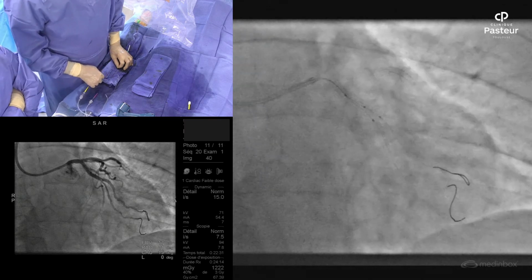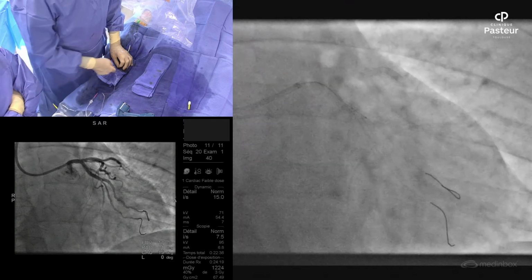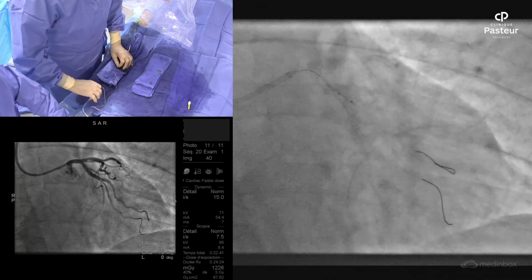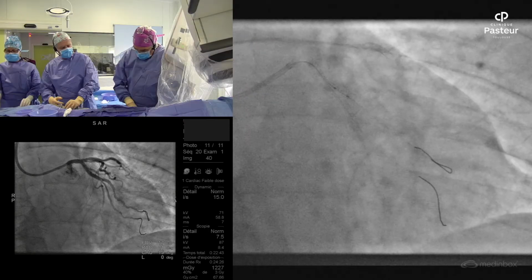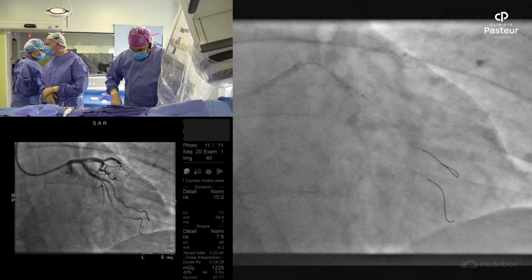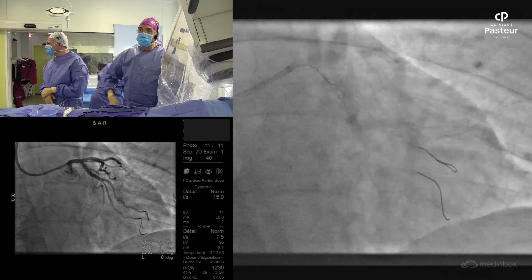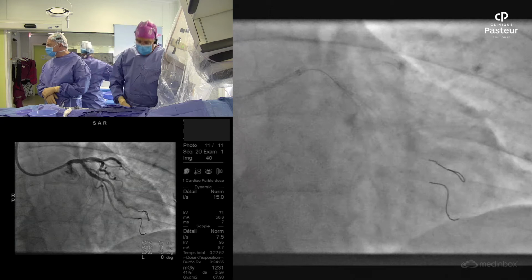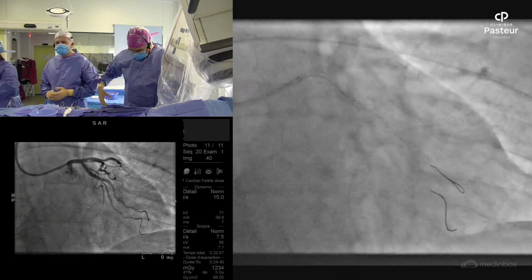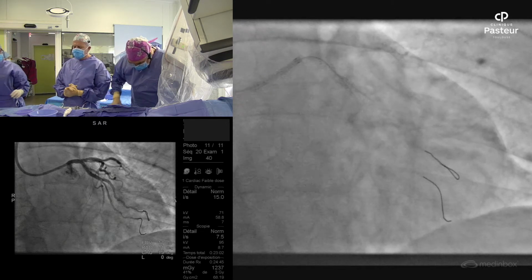Even if the result is satisfactory angiographically, the work is not finished. We have to come back and place a larger, short balloon, using the final POT, proximal to the TAP zone. It will be very important to have good imaging, because we have to place the distal marker of the balloon just proximal to the TAP zone. And this is very, very important.